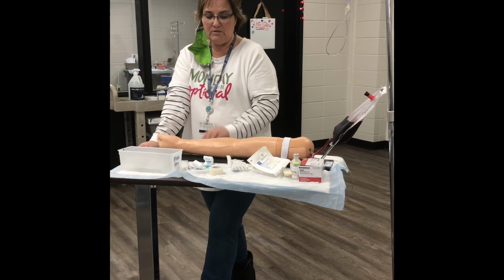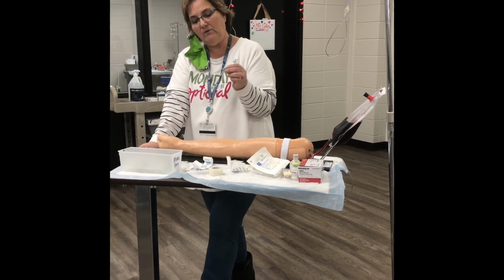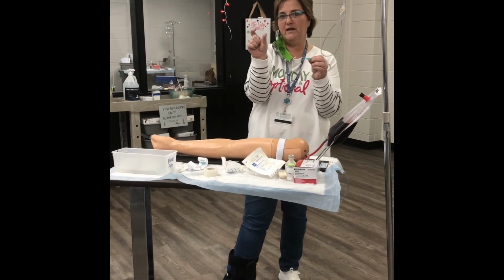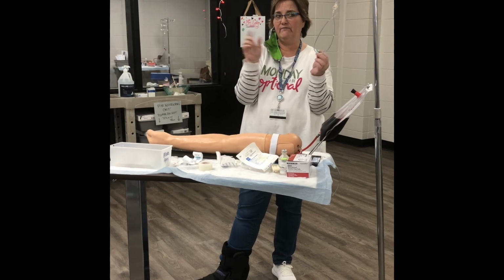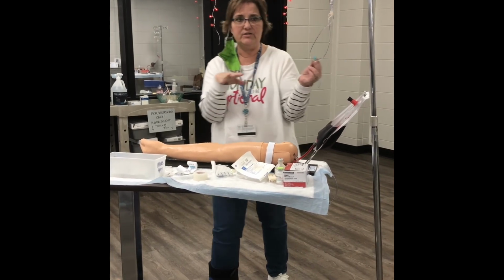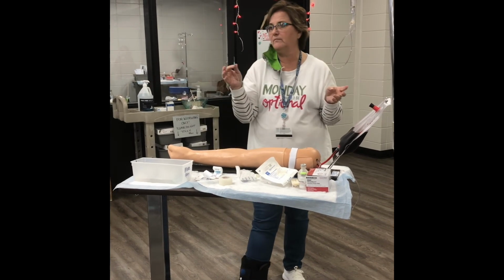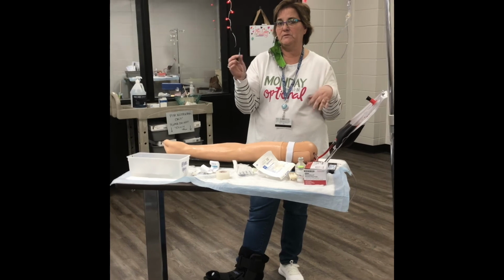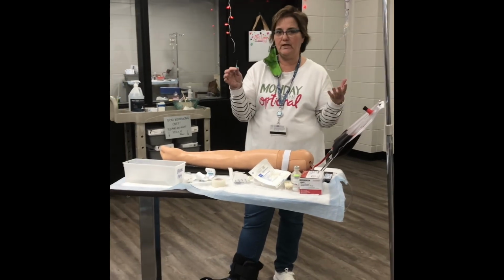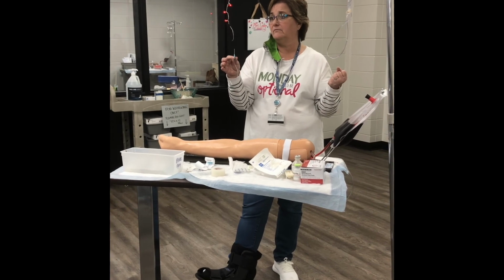And that's it. Then you would just chart that: 22 gauge, 1 inch, and you'll know that from the label that was on the arm. If the label's gone, you can find it in the nurse's charting from the day she started it, okay? 22 gauge, 1 inch needle DC'd from left forearm, catheter intact, site without signs or symptoms of infection, or without heat or redness, pressure held until bleeding stopped. And that's it.